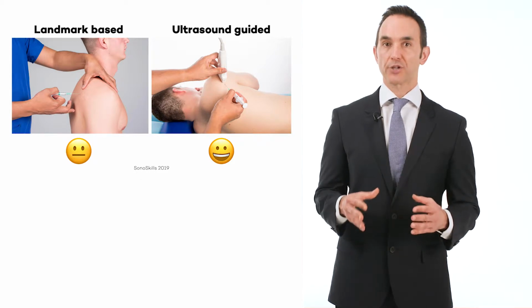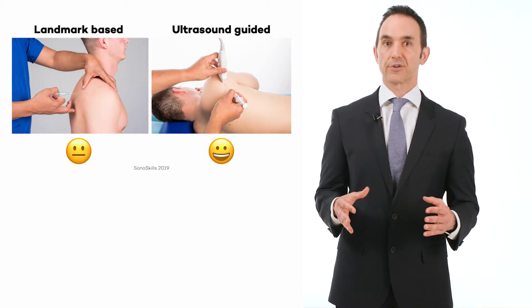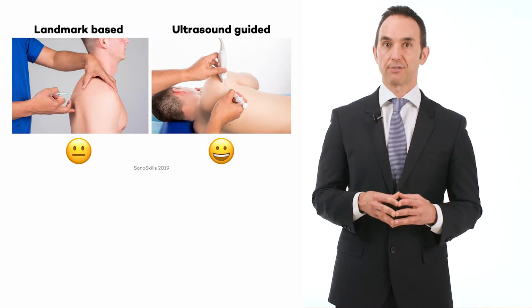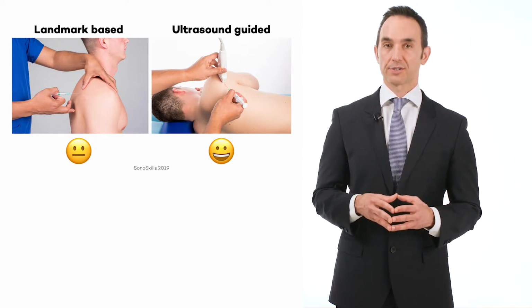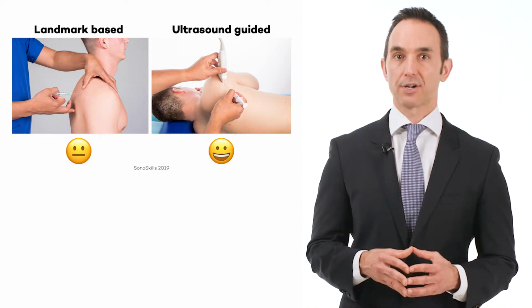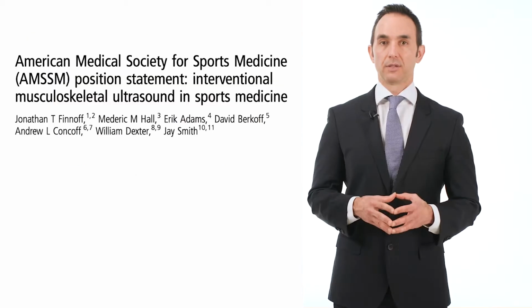As the most common injectant studied in regard to efficacy is corticosteroid, the possible systemic effects of corticosteroid may be a confounding factor when analysing the efficacy of local corticosteroid injections. Further research is required to confirm a more efficacious effect with ultrasound guidance. Similarly, there is only preliminary evidence that ultrasound-guided injections are more cost-effective, as this area has the least research.